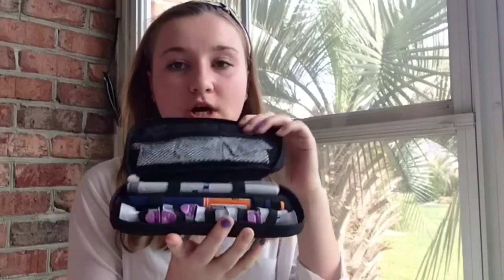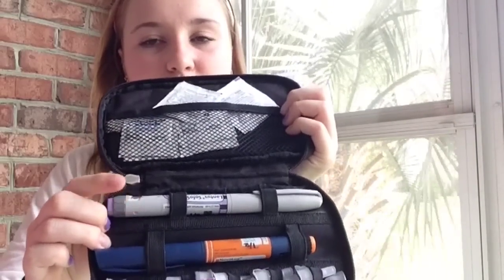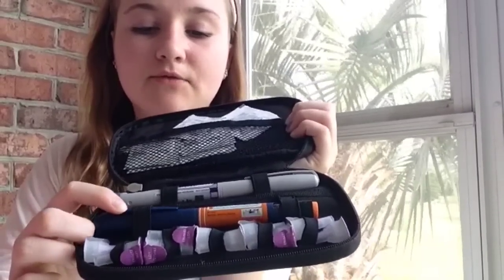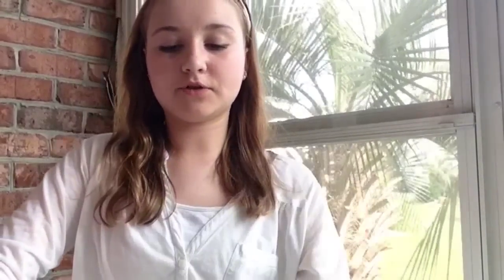The last thing I want to share in my travel diabetes bag is some extra shots. This is for if my pump stops working and I don't have anything else to use to put insulin into my body. In here we also have the alcohol swabs, my Lantus which is what I take at night, and my Novalog which is what I take during the day for meals and snacks. And then you always want to keep some extra needles in there to change the needle out of your shot.